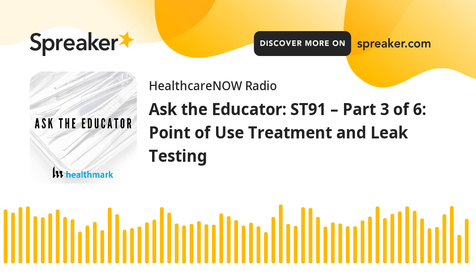It's an excellent point. And then when you get to the decontamination area, we've done pretty much all the steps of the point of use treatment, and now we're getting into the sterile processing or the endoscopy area where this flexible scope is going to be processed. There's a new step initially for the leak tester and testing specifically the leak tester output. Can you talk a little bit about what that new standard says and what we need to change based on what we have historically been doing, and then what the new standards are telling us?